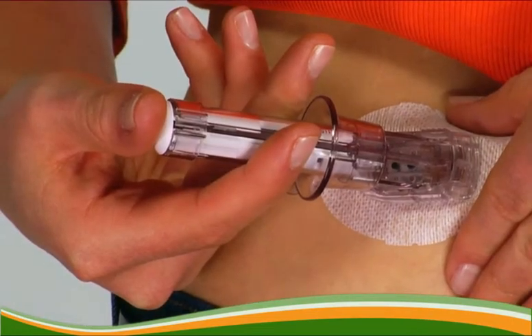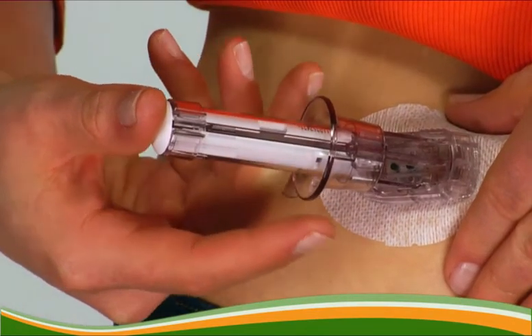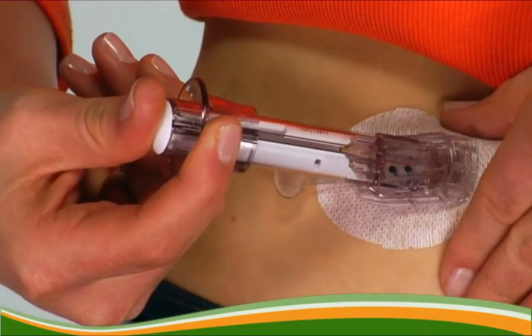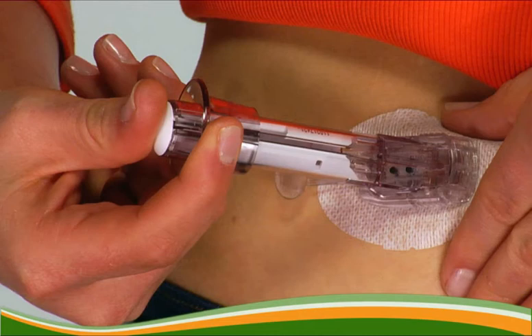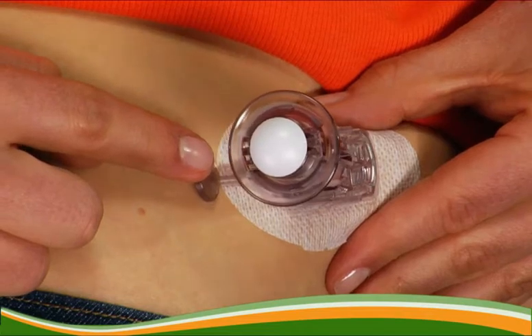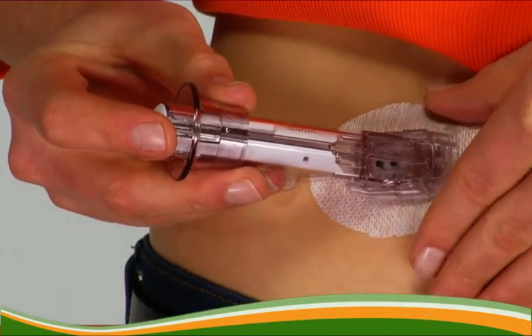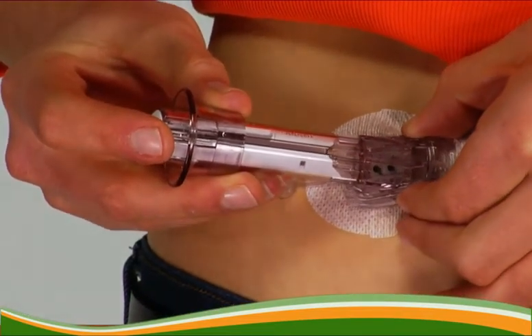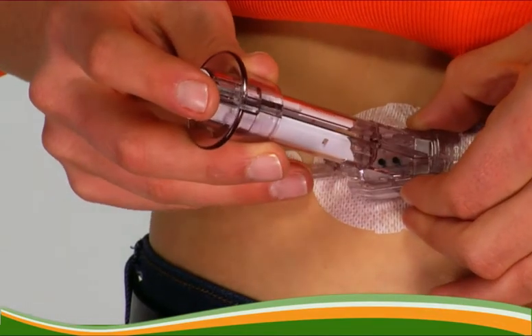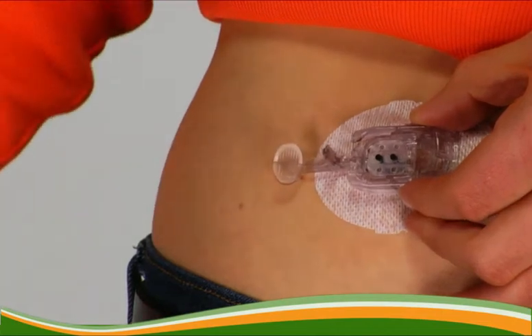Using your thumb as a base, move your fingers from above the collar to below the collar and pull the collar up completely towards your thumb until you hear 2 clicks or cannot pull back anymore. You might feel pressure as you pull back the collar, but continue to pull it back completely as shown. Make sure the transmitter latch is flush against the skin. While still holding the sensor applicator, use your other hand to squeeze the ribbed tabs on the sides of the sensor pod. Rock the sensor applicator forward and out, away from your body.